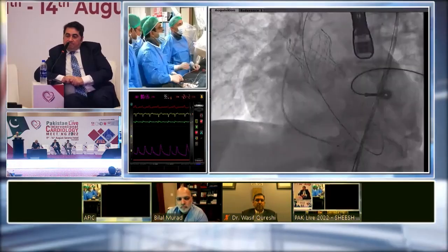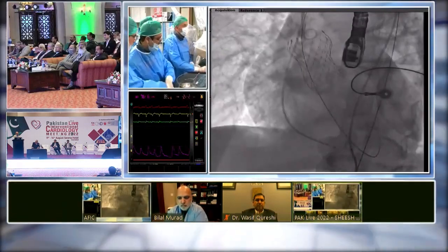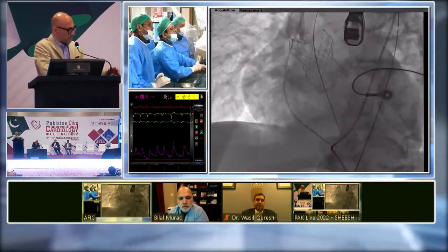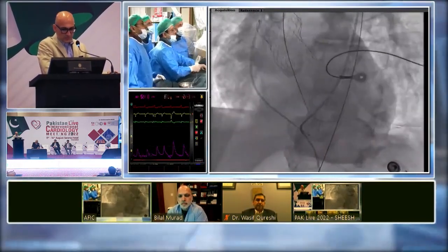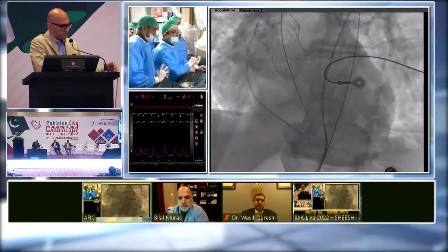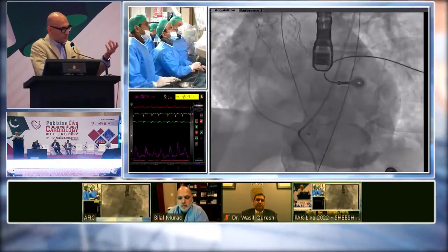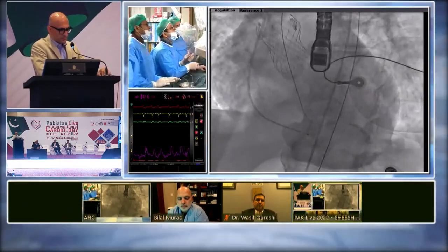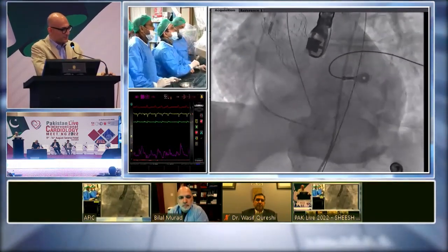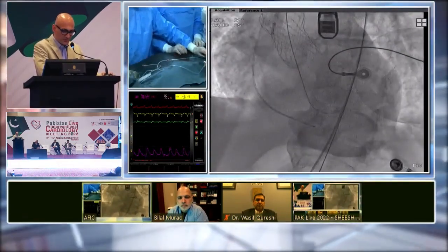So before post-dilating, generally I do assess, if we have TE, then TE assessment, or if invasive hemodynamics, I check a gradient, if there's a residual gradient, or if there's significant AI. Because one, the data is not conclusive on the damage to the leaflets with post-dilation. There's probably some damage which we haven't quantified yet. And the second is, we always go for a higher implant to avoid putting in a pacemaker and reduce our pacemaker rates. And I have a theoretical concern about embolizing the valve or causing some sort of issue.